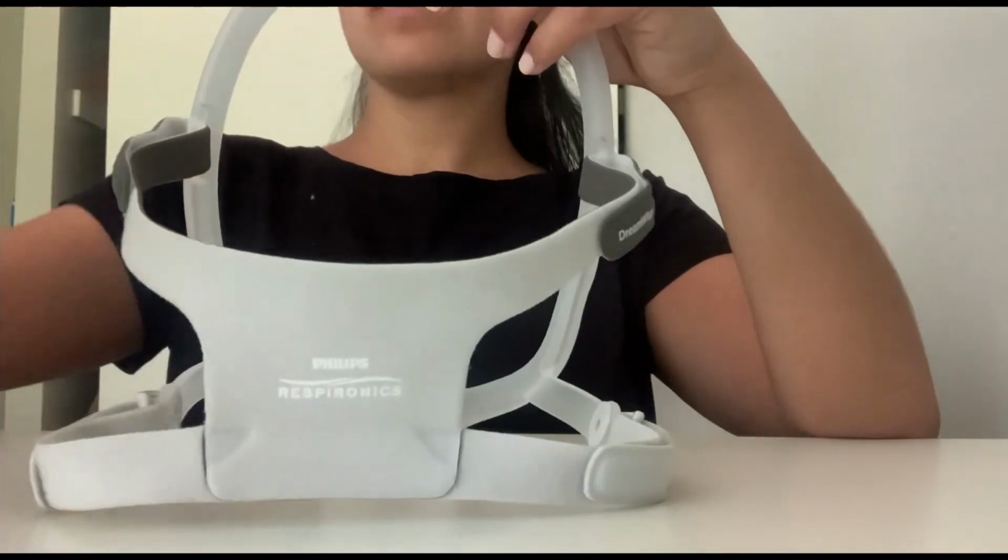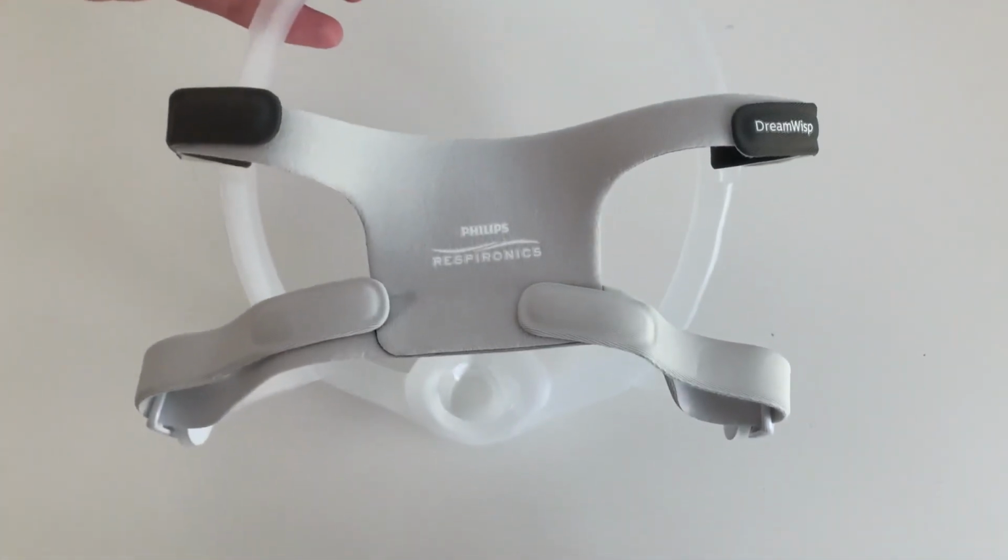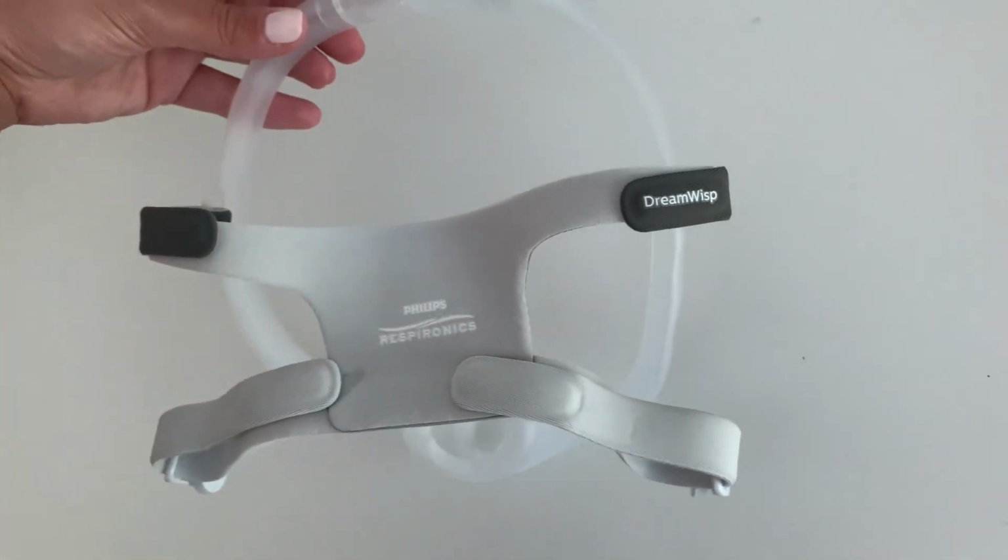It's important to keep your headgear clean to ensure proper functionality. We recommend hand washing your headgear after every use with mild soap and warm water.